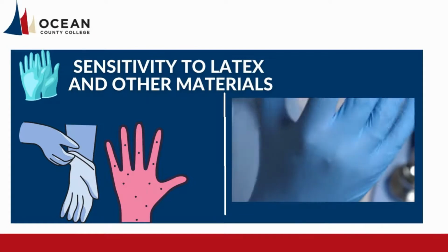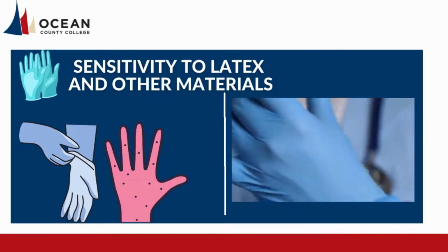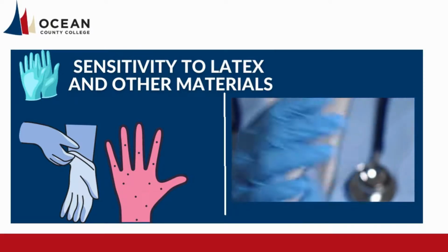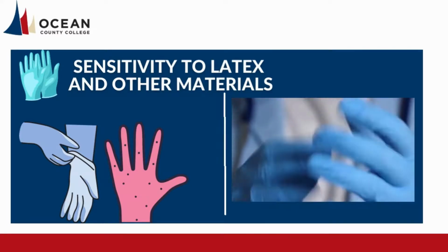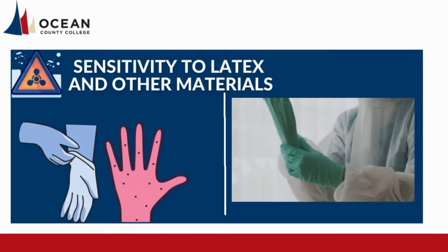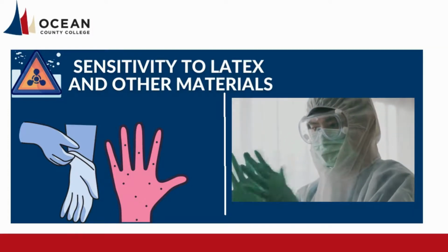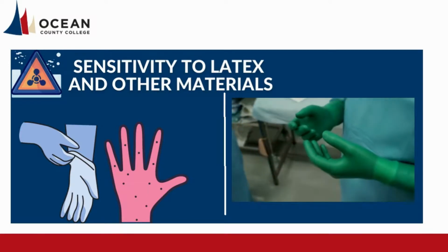Latex sensitivity is an important problem in the healthcare field. Today, many healthcare facilities have stopped using latex gloves, replacing them with stretch nitrile or vinyl. The reaction to latex products can take a variety of forms such as irritant contact dermatitis, allergic contact dermatitis, and anaphylaxis. Individuals with known sensitivity to latex should wear a medical alert bracelet. Patients should be asked about allergies or other reactions to previous latex exposure. The substances causing latex allergy are similar to ones found in chestnuts and some tropical fruits, such as kiwi, avocado, and banana. Patients should be asked about allergies or reactions to any of these fruits.